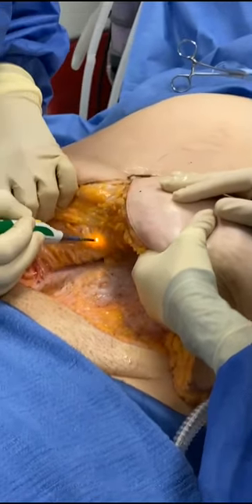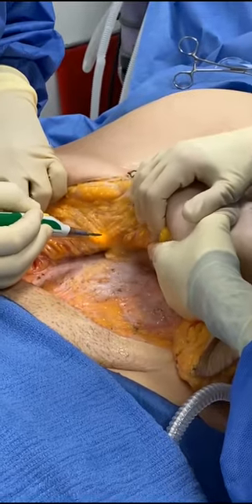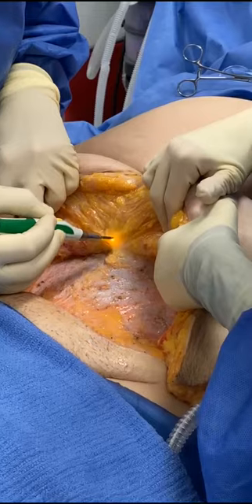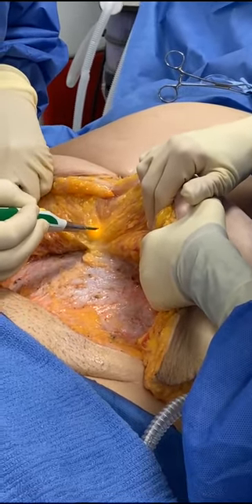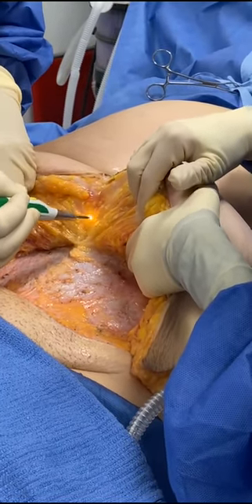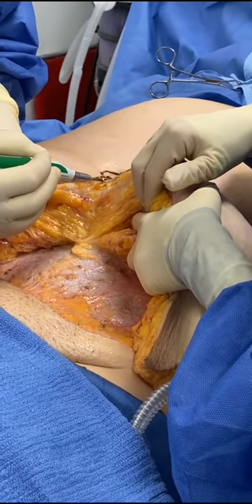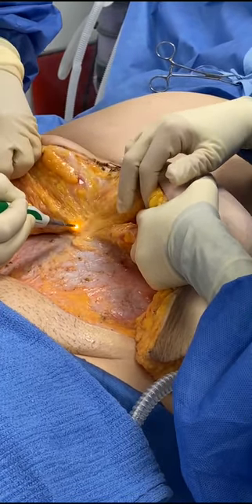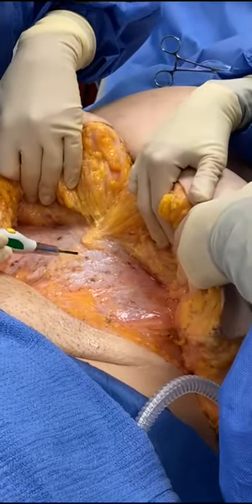Right now, we're basically isolating the belly button, so we're gonna go all the way down, and we're gonna show you what is called the umbilical stalk. It basically attaches to the fascia, right? She does have a significant amount of excess fat that, thanks to God, we're gonna remove. She's very excited about this procedure, and this is the fascia. Look how white and beautiful it is. Look at that, gorgeous, no bleeding at all.